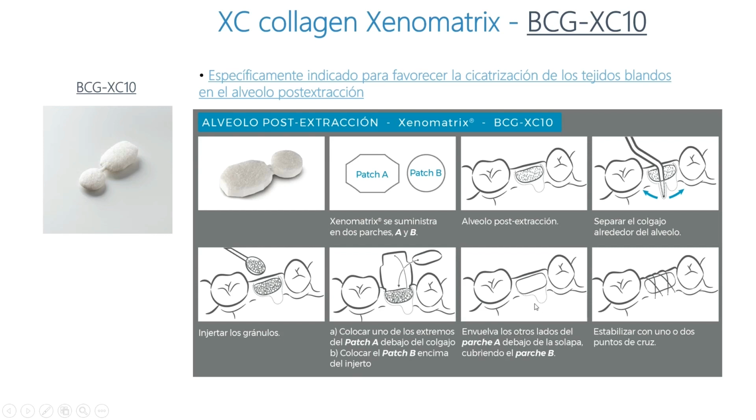So here is how it looks when the graft is covered by the two patches, and then in this case the Xenomatrix is stabilized by sutures.